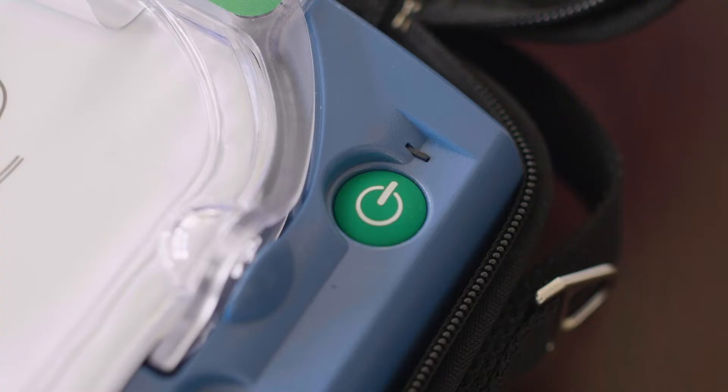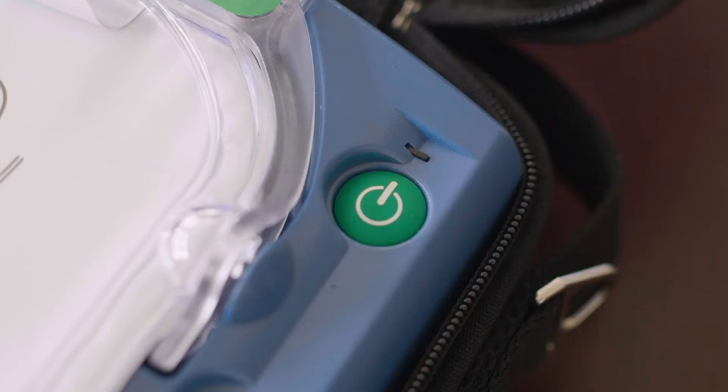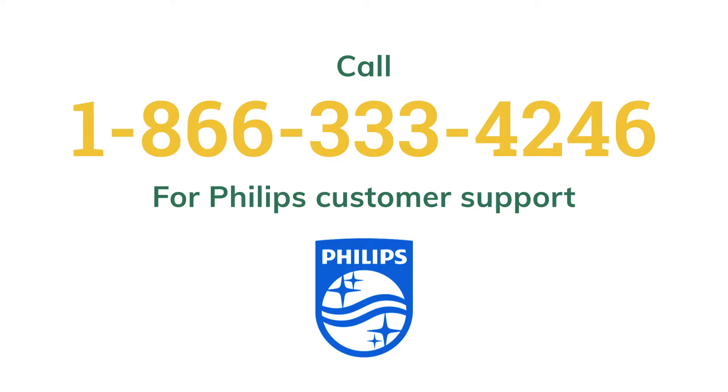If you didn't hear a voice during the self-test, or if the device tells you the shock button was not verified when you pressed it, or if the green ready light is not blinking at the end of the test, call 1-866-333-4246 for Philips customer support.